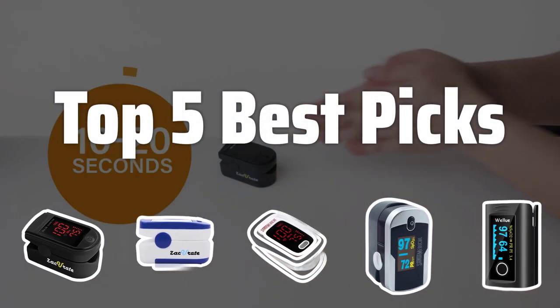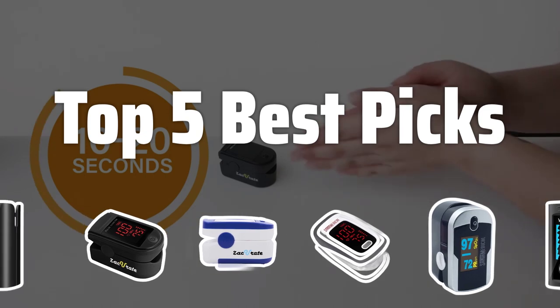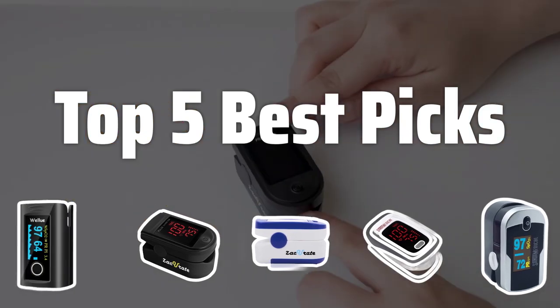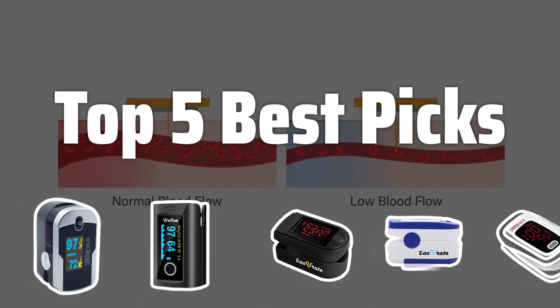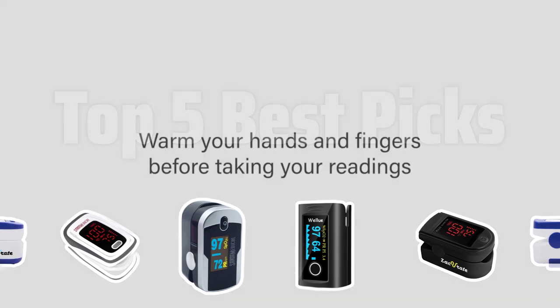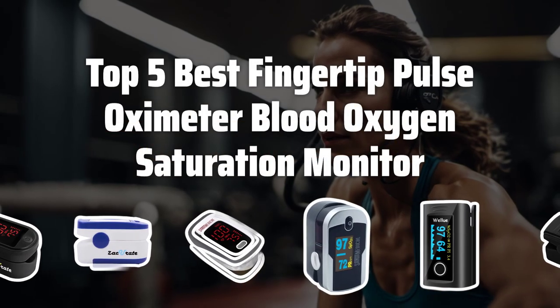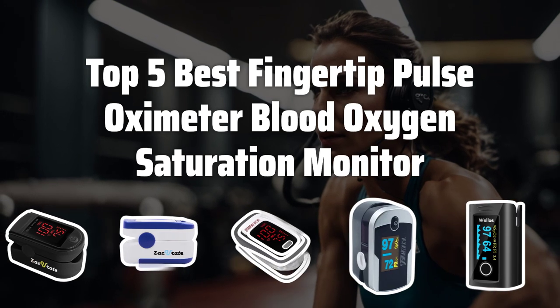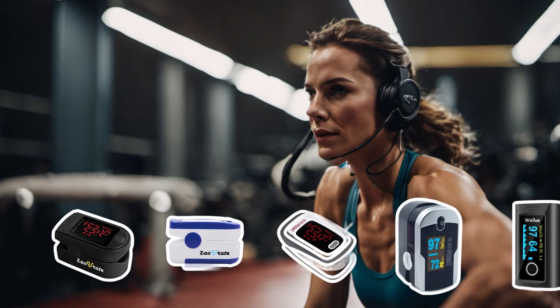Welcome to Top 5 Best Picks. The best athletic and aviation pulse oximeters is probably one of the most important tools to have in your health arsenal. Today, we are going to dive into the Top 5 Best Fingertip Pulse Oximeter Blood Oxygen Saturation Monitors to help you make an informed decision. Now let's take a look at the Top 5 Best Fingertip Pulse Oximeter Blood Oxygen Saturation Monitors we chose for you.